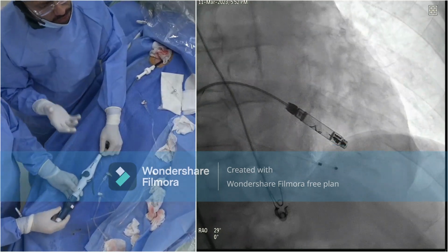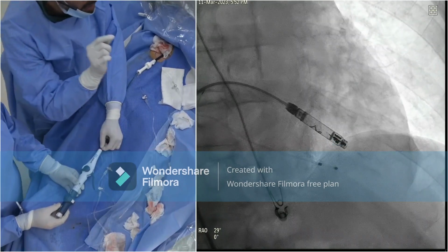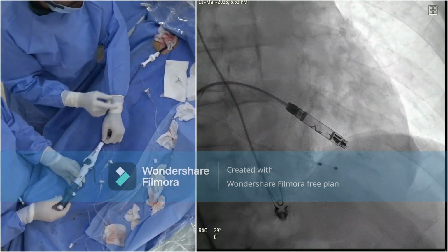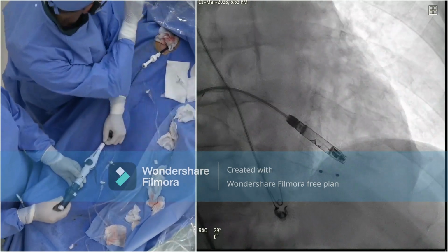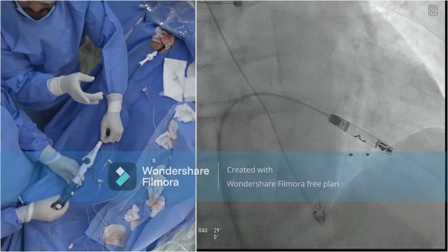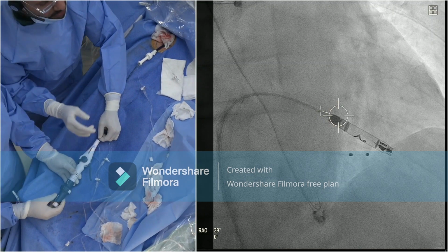So Dr. Raed was referring to the gooseneck that we mentioned. No need for gooseneck when it comes to AVEIR. So now we will fix this as our roadmap. We need to fix the cine, please, as a marker for us. Okay, we need 1 minute. Okay, so fix it, please. Okay. And now we're going to start.